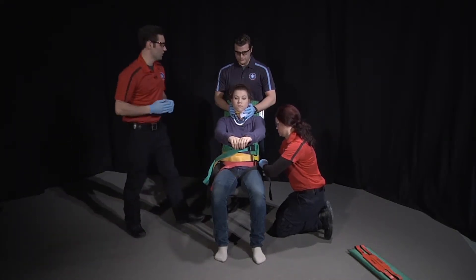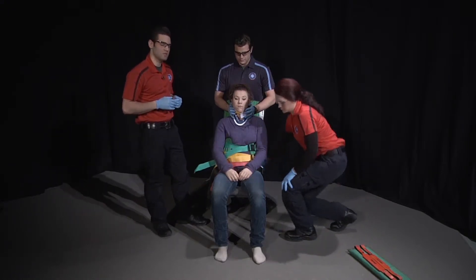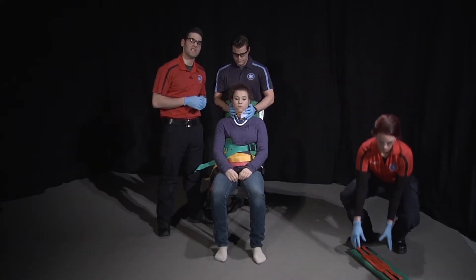Once the torso is secured, we'll then pad behind the patient's head as necessary and secure the patient's head to the device.